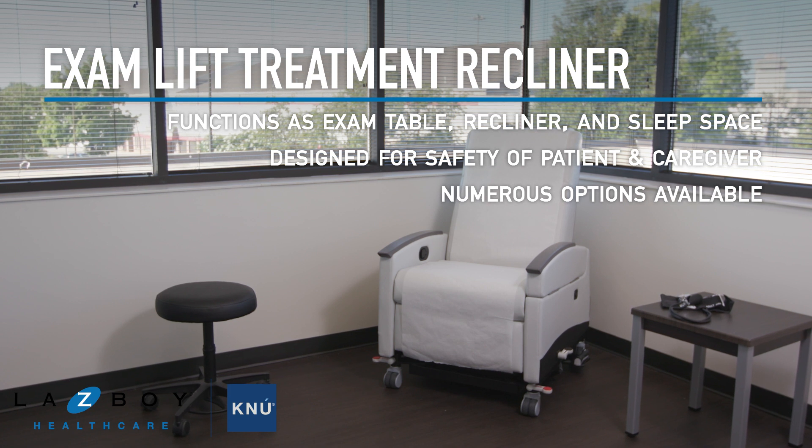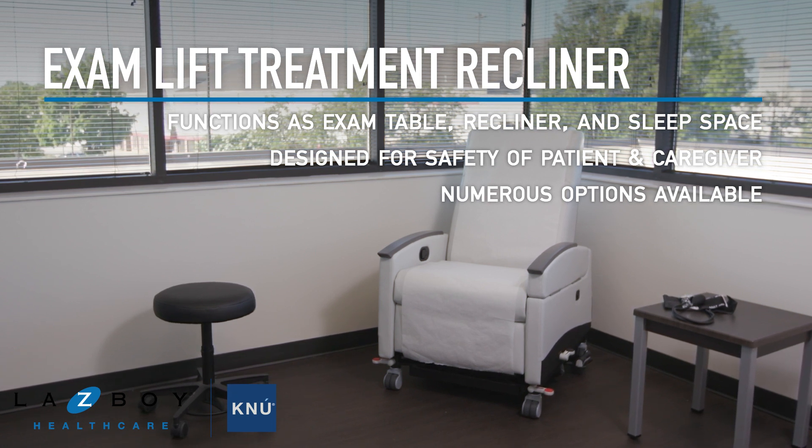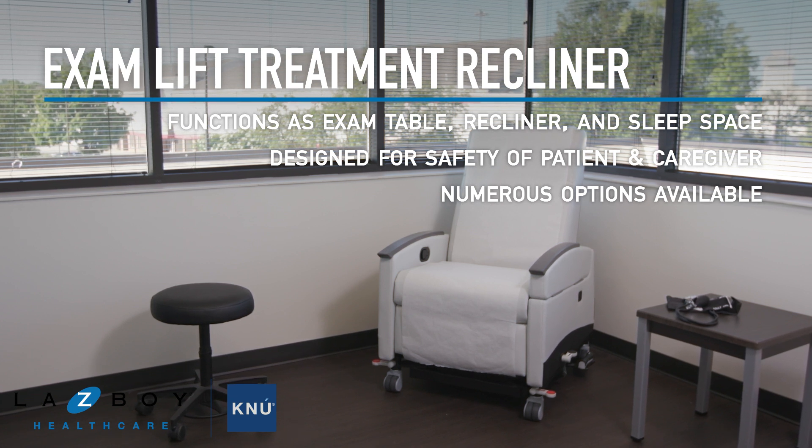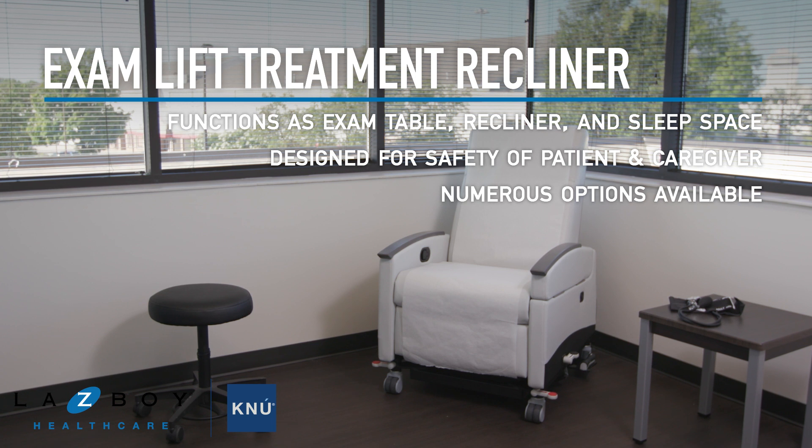This recliner eliminates the intimidating form factor of the traditional exam table and lifts patients to a height comfortable for the individual caregiver, avoiding strain and allowing full focus on improving health and wellness.